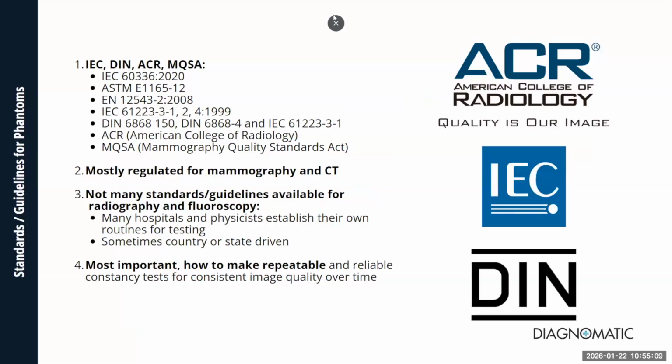So DIN, ACR, and MQSA describe the general norms that phantoms have to fulfill. So having this phantom and knowing that it complies with the norms, you can be sure that this phantom is comparable with another vendor's, another producer's phantom: they have the same design, the same tolerances, they fulfill the same norms, so they can be used equivalently.